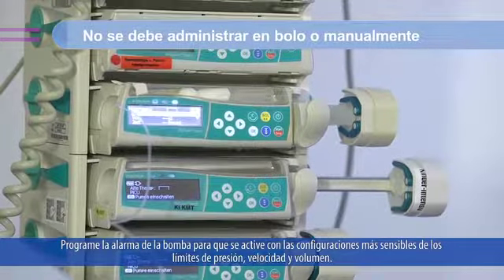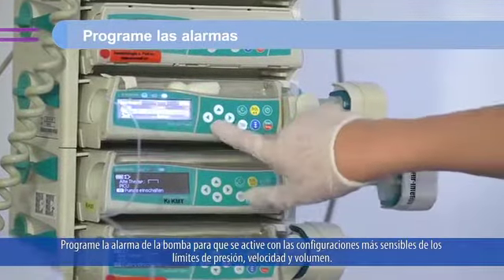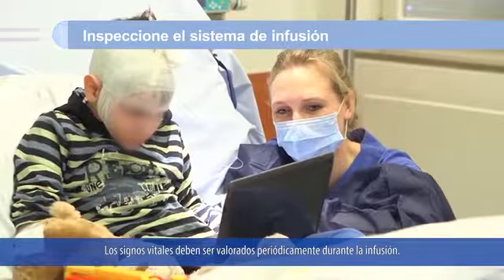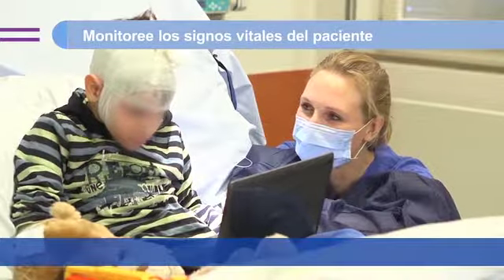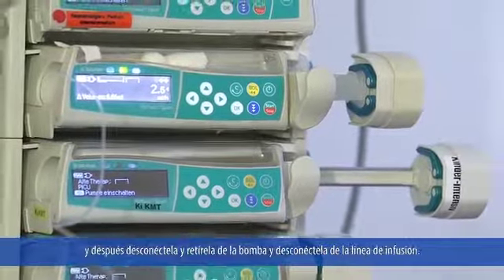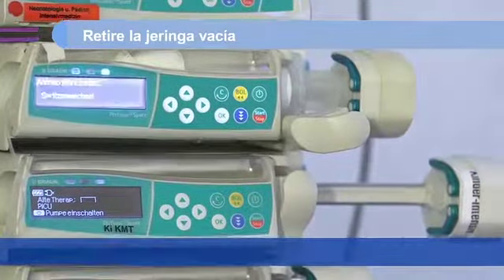Set the pump alarms to sound at the most sensitive settings for pressure, rate, and volume limits. Periodically inspect the components during the infusion for signs of leakage or delivery failure. Vital signs should be monitored periodically during the infusion. After the infusion is complete, check that the syringe in the syringe pump is empty. Then detach and remove it from the pump and disconnect it from the infusion line.